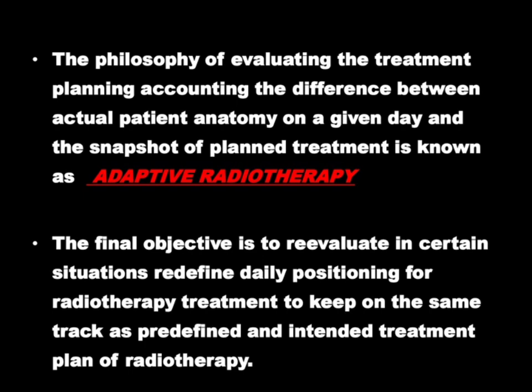Hence, we need to develop a strategy to measure, monitor and correct these uncertainties. So this leads to the evolution of various in-room imaging technologies which enable us to correct the setup errors and anatomical changes related to weight loss or movement of internal organs.